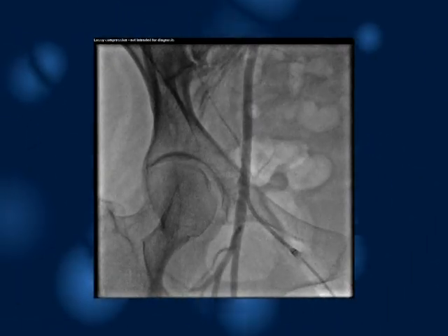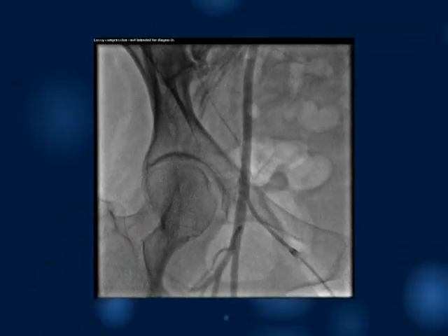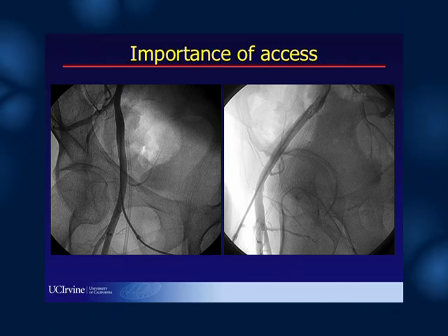The angiogram shown here shows placement of the sheath in the correct location. The subsequent important aspects of both RAO and lateral views of the femoral artery demonstrate that in the RAO projection, separation of the profunda and superficial bifurcation will permit the operator to identify the fact that the puncture site is indeed away from this bifurcation.